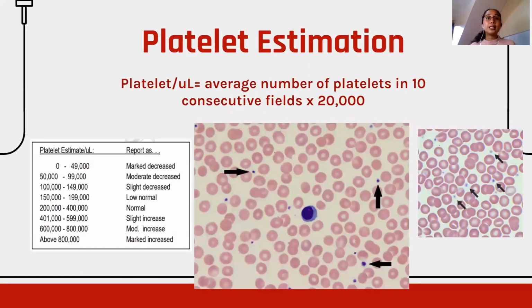Diba? Na BCF and DF. And class, platelet estimation. So, class, actually, this is my guide when I was working in the hospital. So sometimes your machine flags, so that you could just estimate and check the correctness of the count. So you could do platelet estimation. So once you make a blood smear, gumawa ka ng smear and you stained it and dried it down, under oil immersion you could count the platelet.